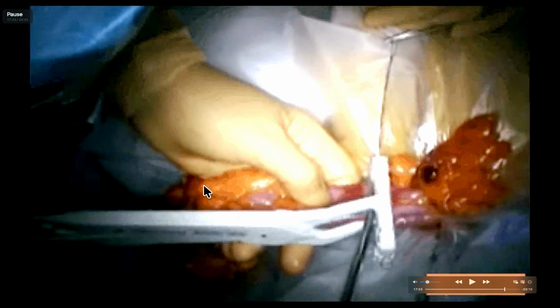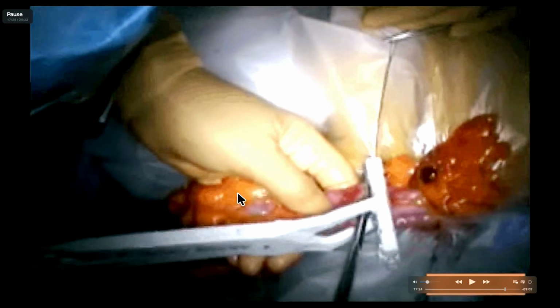And do you know what is this? Sigmoid. And what is this? Descending colon. Now it is sealing, and then these are scissors, and the scissors are cutting out the sigmoid colon, and the sigmoid is detached from the descending colon, and it will be sent in a specimen bag for biopsy.